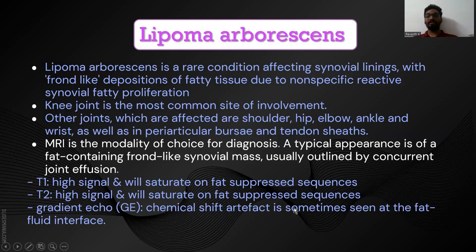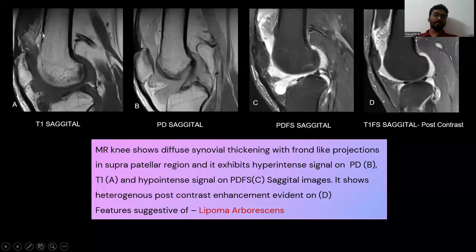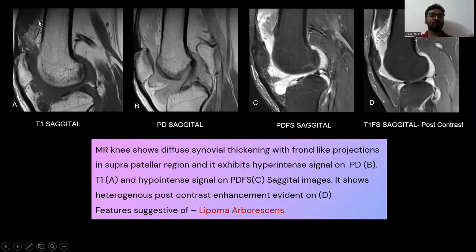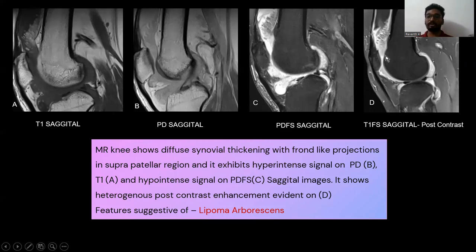On gradient echo sequences, a fat-fluid level can sometimes be seen. In our case, the patient came with knee pain. There is a frond-like mass in the suprapatellar region appearing hyperintense on T1 and PD, and hypointense on PDFS. On post-contrast, heterogeneous enhancement is seen, suggestive of lipoma arborescens.